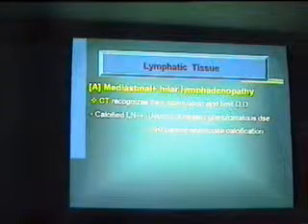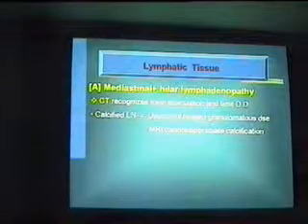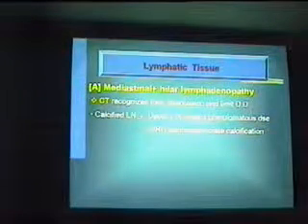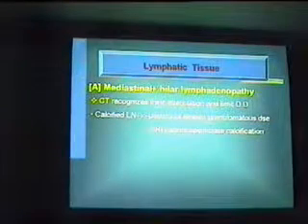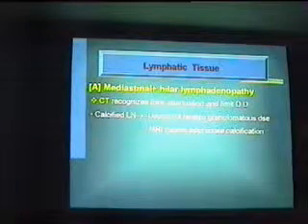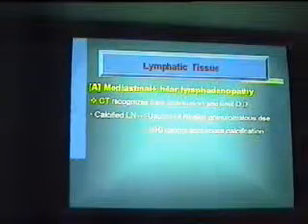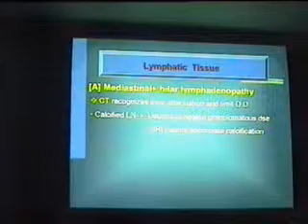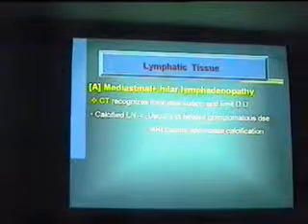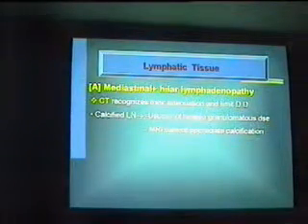حواليهم دائما وابدا في vessels. فبين cut and cross section هيبانوا دائما مدورين فاقدر افرقهم بينهم وبين الفيسلز اللي نير باي. They really take up contrast but not to the extent of the vascular structures. السي تي بيوريني الكالسيفيكيشن الموجودة في الليمف نودز. طبعا الام ار ما بيورينيش الحكاية دي. ولو لقيت كالسيفيكيشن within lymph nodes يبقى الدايجنوسيس of granulomatous affection is more common.